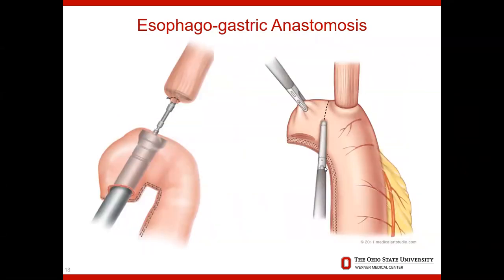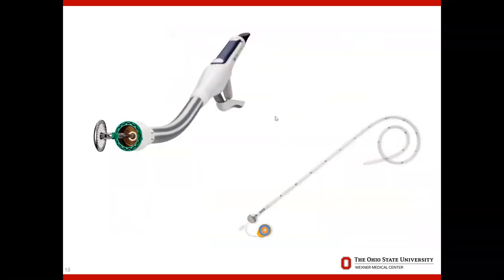The esophagogastric anastomosis is performed with a circular stapler inserted into the stomach and deployed on the greater curvature. An anvil is placed within the esophagus, connected to the circular stapler, then closed and deployed to create a perfect esophagogastric anastomosis. The excess stomach is then removed with the linear stapler. Shown here are the circular stapler and the anvil used to perform the anastomosis.